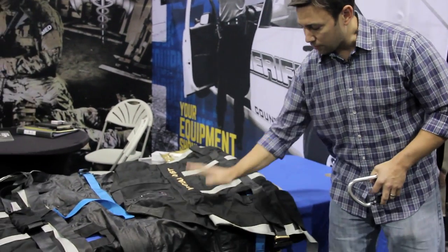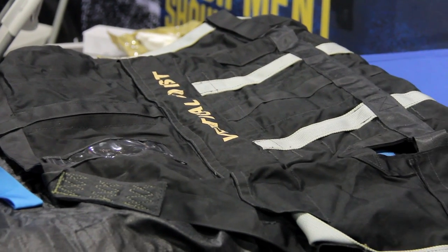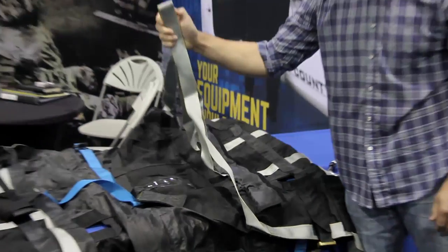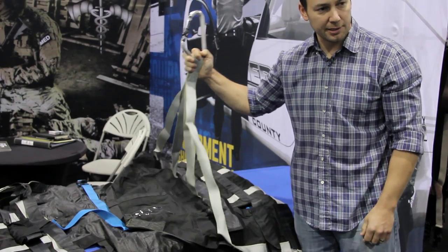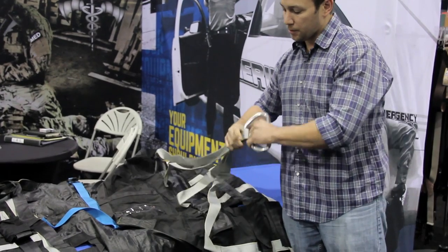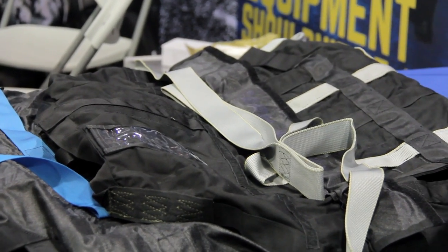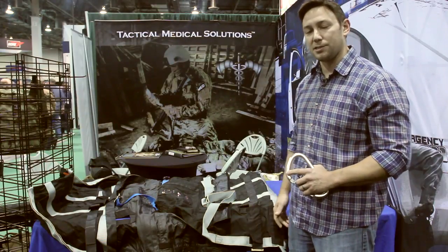Pre-rigged on the back is a vertical hoist pocket — labeled 'vertical hoist' so you can't mess it up. In a vertical hoist situation you draw that rigging out of the pocket and it's a single attachment point for your main carabiner to take your casualty vertical, whether aerial, confined space, or otherwise. For night operations there's also a chem light pocket for an IR chem light, so you can locate the head of the casualty from the ground or air, and tell if the casualty is spinning under night vision in case of tagline breakage.